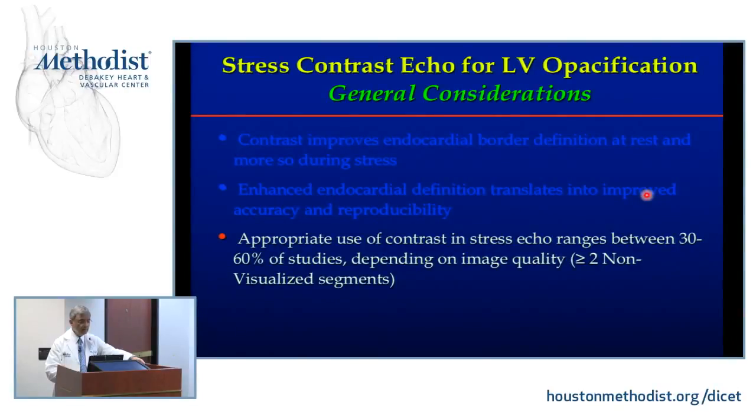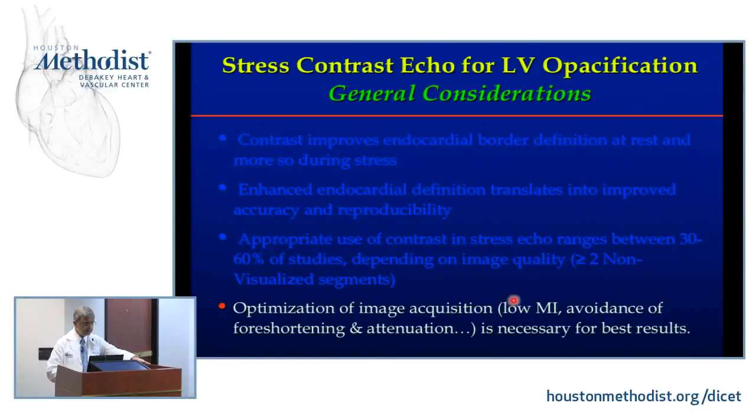reproducibility is better. I don't know. I really think personally the appropriate use is somewhere close to maybe 60% or so. It's not 100%, because if you use it 100% of the time, so if you have pristine images, I would stay with them. Actually, I had some pictures where you had a beautiful echocardiogram, and it will actually deteriorate if you use contrast. So you got to be very careful about that. Optimization is necessary. I mean, your imaging window may be a little different. For every time you use contrast, almost re-image the heart so you can see the whole areas about the heart.